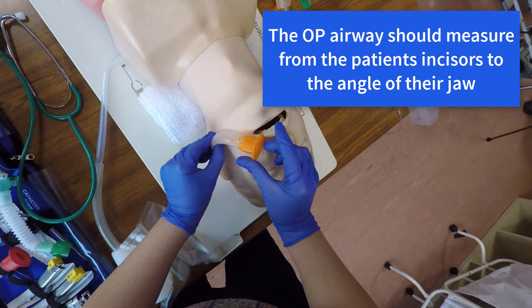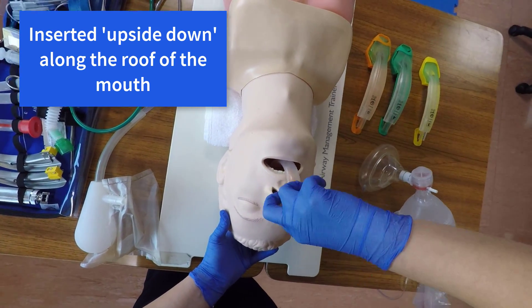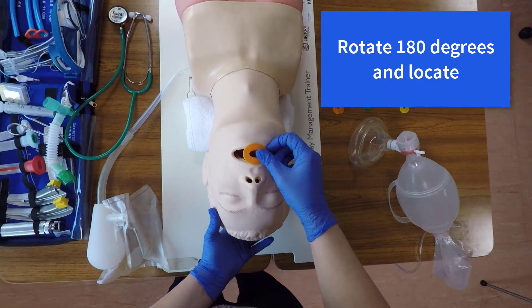Consider using suction. The OP airway should be measured from the patient's incisors to the angle of their jaw. Insert it upside down along the roof of the mouth, then rotate 180 degrees and locate it in position.